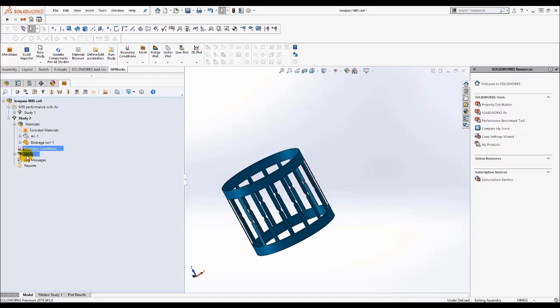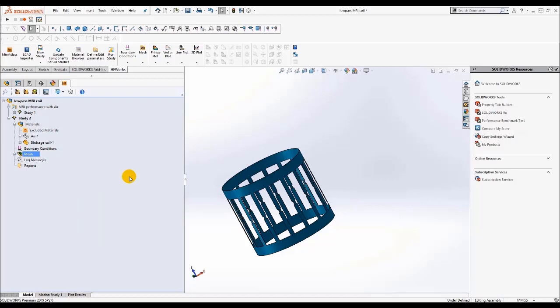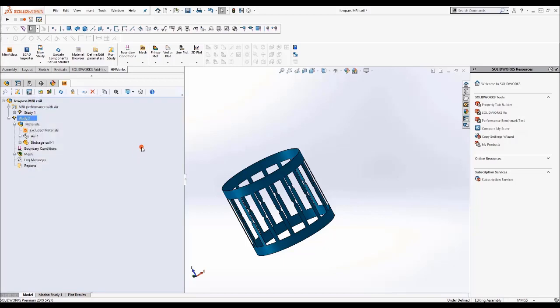And finally, the meshing step. You can create your mesh, the automatic mesh with the default settings, or just add some mesh controls in case of adaptation. Also, you can create your adaptation study based on an existing mesh with user-defined mesh controls. Once all of these steps are done, you just right click and run. The thermal solution is a post-processing analysis, so once the electromagnetic is done, you can create your thermal coupling case with the thermal boundary conditions and solve it separately from your main electromagnetic part.